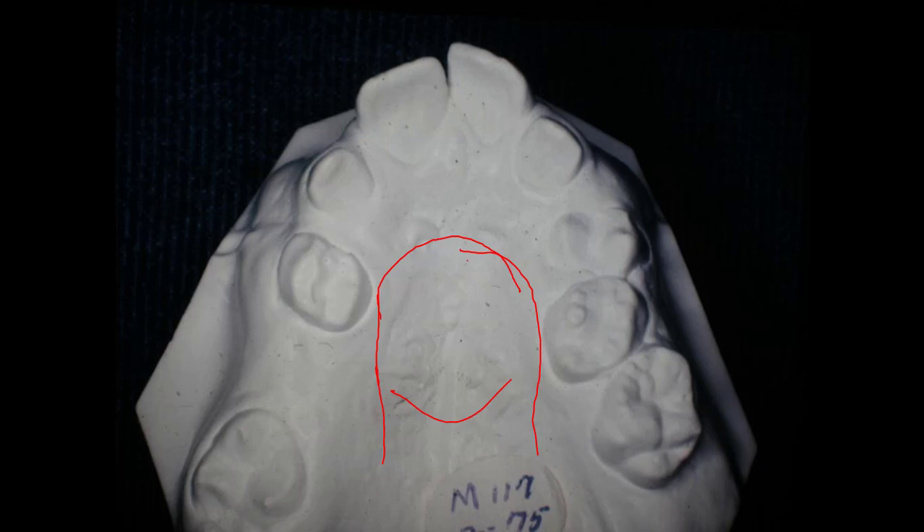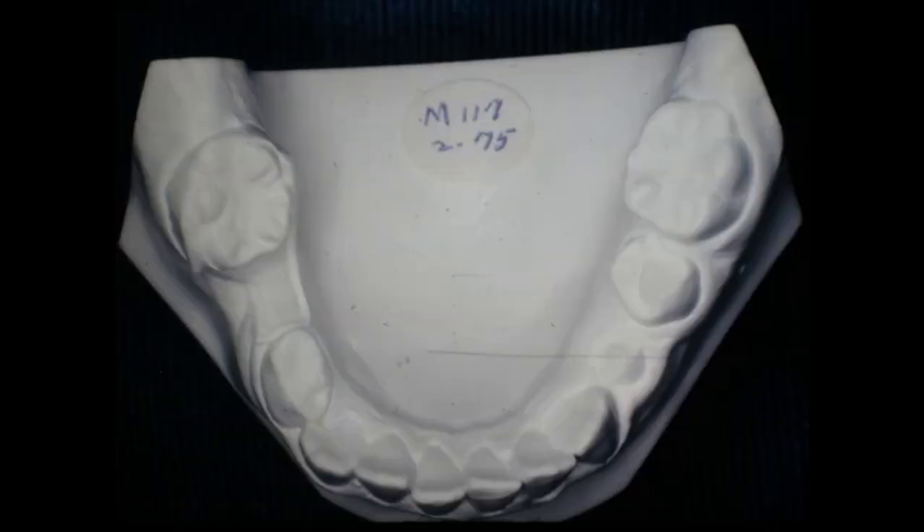I actually used two palatal separators to get it out that wide. This is just to show you the bottom arch, which was fairly normal in shape. This was a space maintainer she had in there when she came in, and there is a bicuspid down underneath here. So you'll see that as we go along.